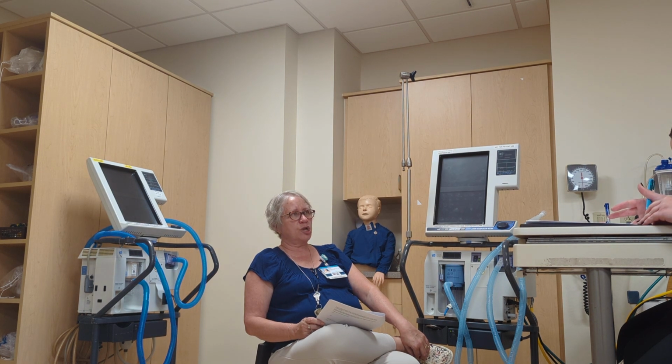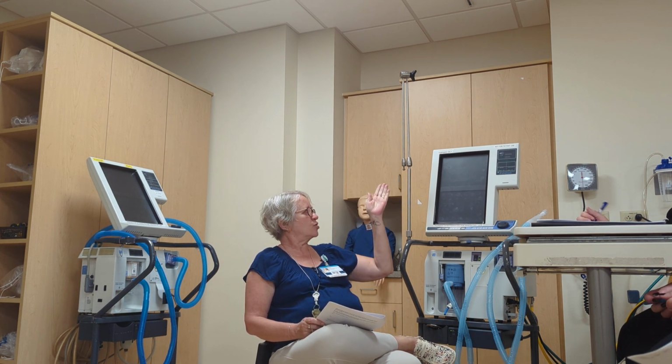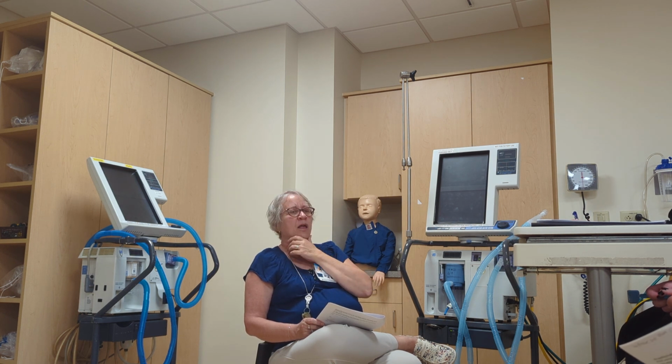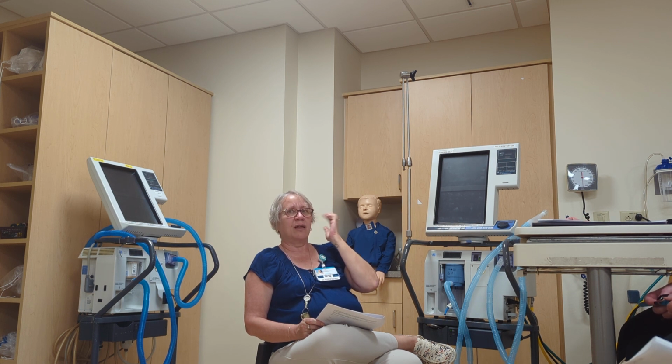So that would be 2.89 milliliters per centimeter of water pressure. That's what that means. So for every 1 centimeter of water pressure that your ventilator generates, you're going to lose 2.89 milliliters of volume. With big adults, not a big deal. Little babies, huge deal. When you have little baby tidal volumes of 50 and you're losing 5 milliliters, that's a big deal to a little baby. But you want to know.